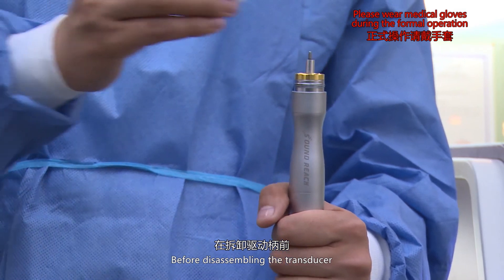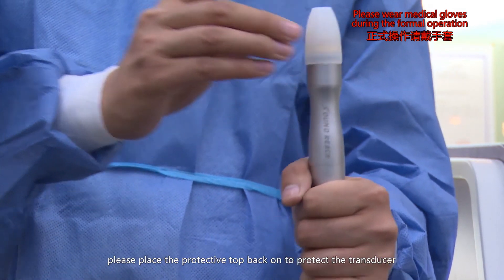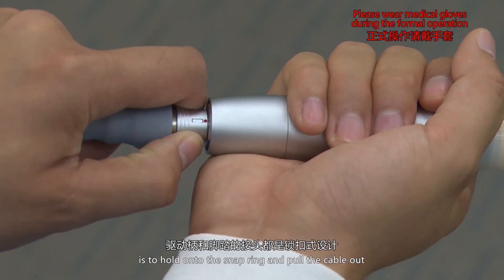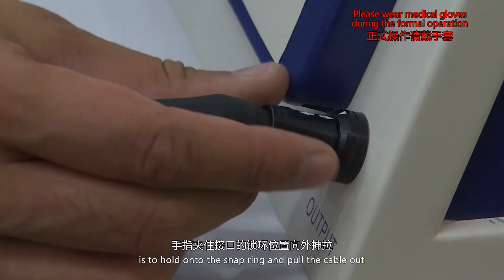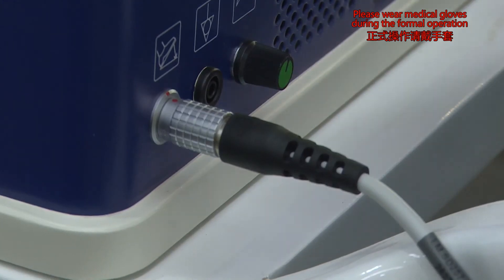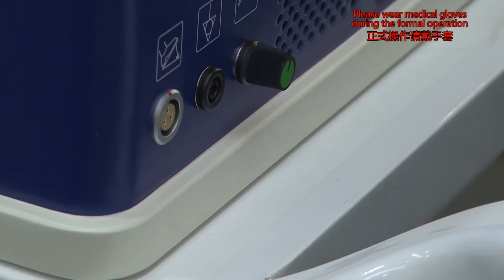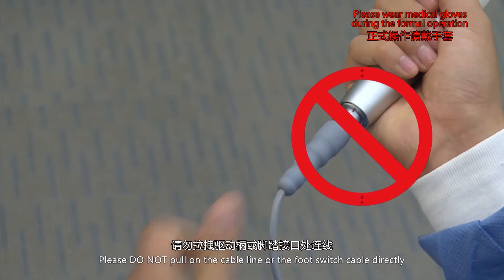Before disassembling the transducer, please place the protective cover back on to protect the transducer. The correct way to disassemble the transducer is to hold on to the snap ring and pull the cable out. Please do not pull on the cable line or the foot switch cable directly.